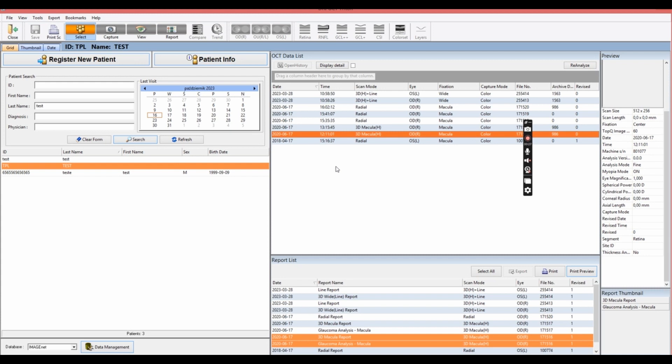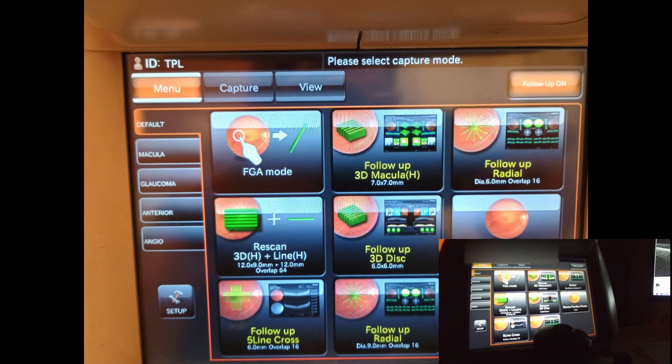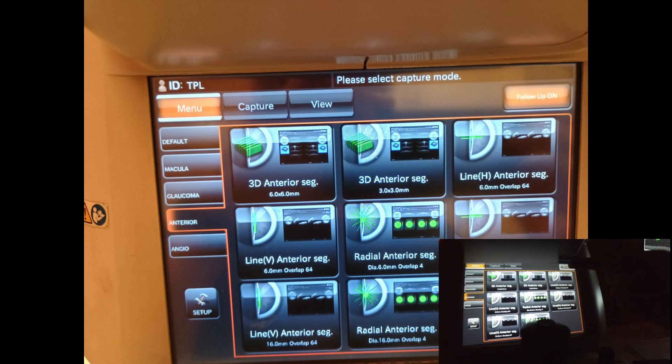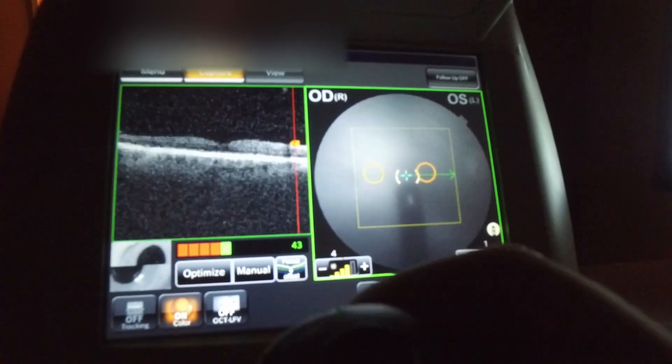Let's start with the software. Let's register a new patient. Here you can add all the information including the refractive error and the axial length for the patient, so it's pretty sophisticated and extensive. Once you add the patient you can take images. This is the display on the machine: we have default, macula, glaucoma, anterior, and angio. For glaucoma there is my favorite scan which is 12 millimeters, containing both the macula and the optic nerve, anterior segment, and also angio. You can click follow-up and there will be a follow-up scan for those scans taken before.